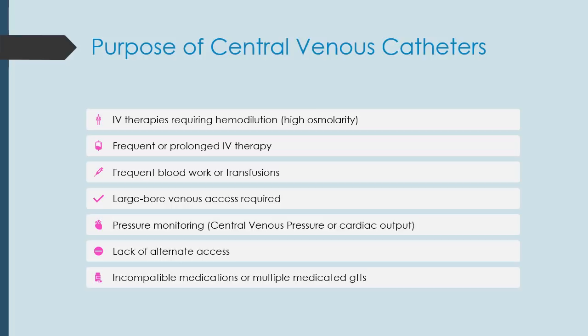If your patient's receiving frequent blood work, a central line might be a good choice for that patient. Basically, you can use the central line kind of like a faucet to draw out blood, and you don't actually have to keep poking and repoking the patient.